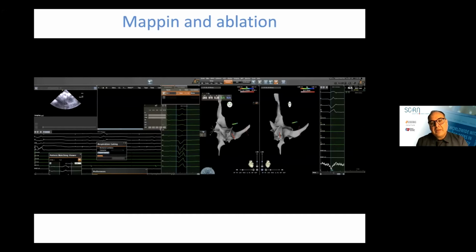Is it the mapping was not an ablation catheter? It was a DECA-NAV catheter. It was a diagnostic catheter. Yeah, but that is a manual map that you did, right? So you've done, or did you? So now again, I'm trying to play devil's advocate. So if you've done all the mapping, you've identified your target, and you change to magnetic navigation for the last 5 minutes where you just deliver the energy. What makes you do that? Why don't you just go for a manual ablation catheter at that point?